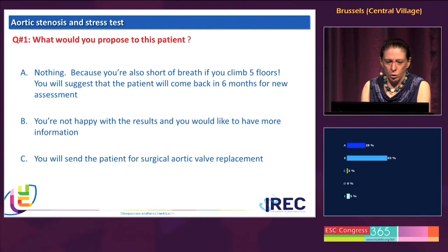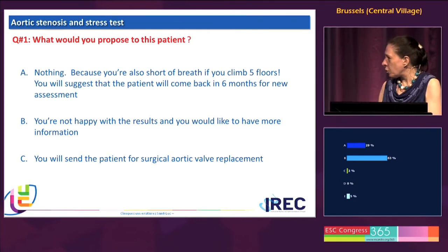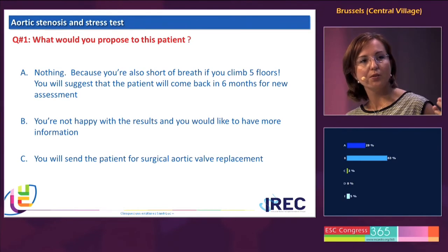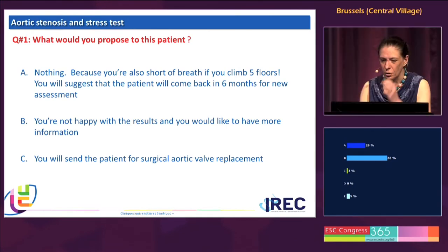Okay. So we go to the result of the vote. If I may comment, actually, if you have a good image quality, you can also take a 3D data set and cut the valve above and look from the other side, from the aortic root perspective. And sometimes, because you don't have the through-plane motion, you are able to see exactly how much it opens. Yes. Okay.